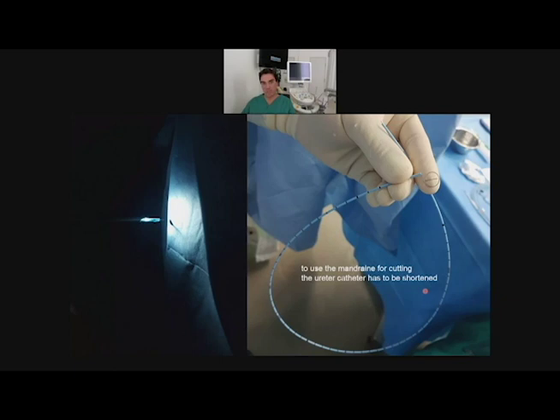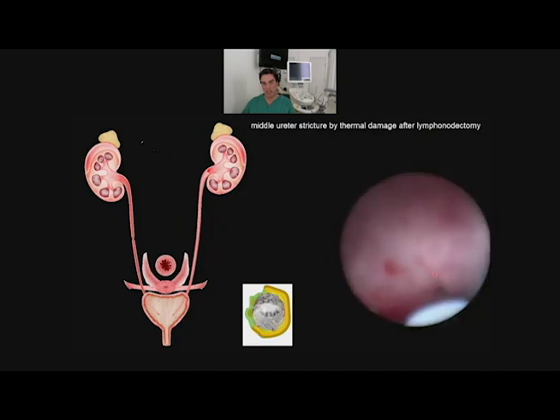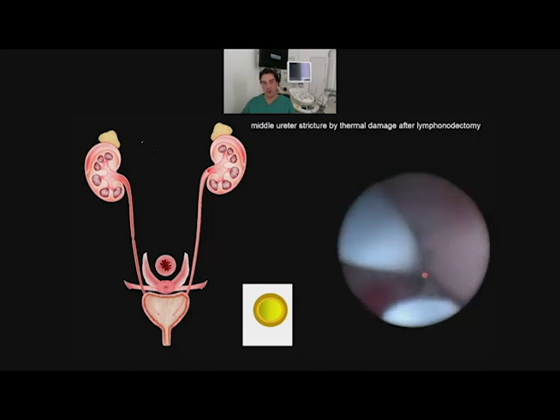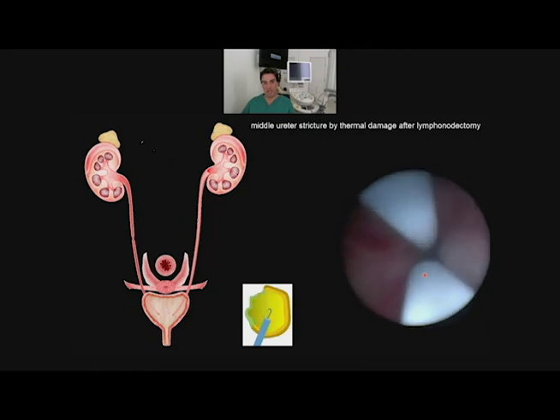What you see here now is the stenosis nearby the iliac vessel after a gynae treatment, after endometrium carcinoma. They burned it really straight. Before, the nephrostomy was inside, and I find the way. What you do now is to open that stricture. It is not recommended to make only a dilatation and put a stent inside, because if you later take the stent out, the stenosis can come again.